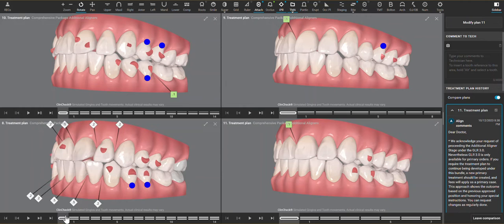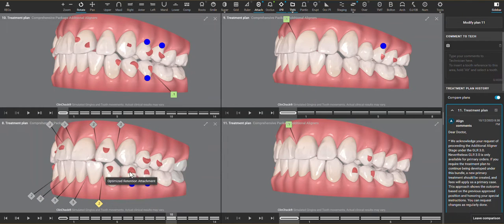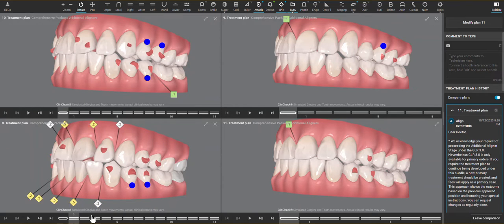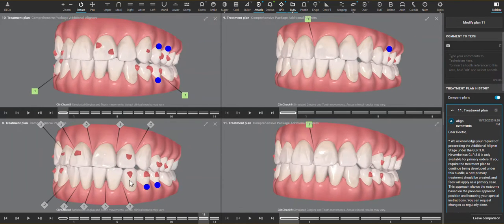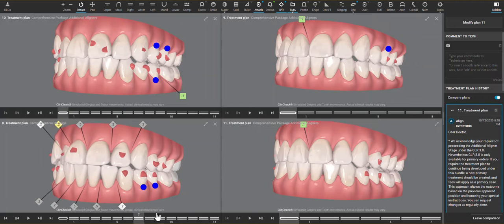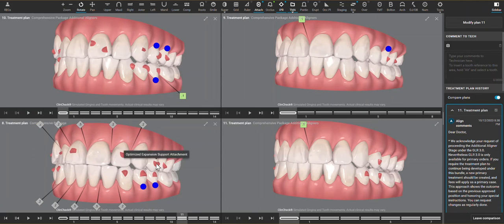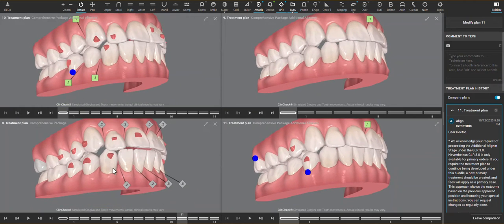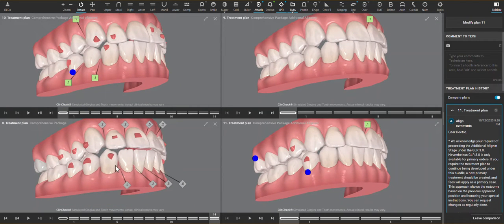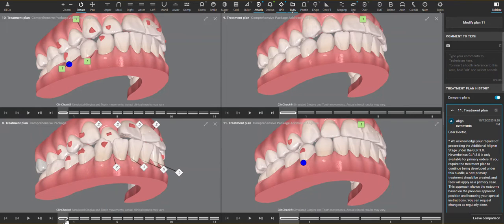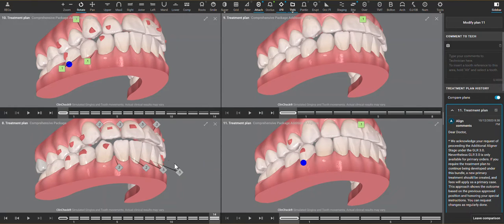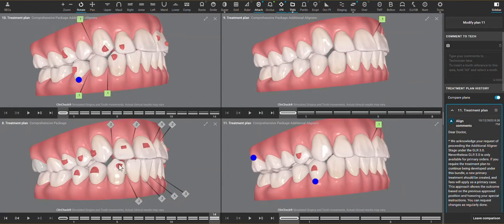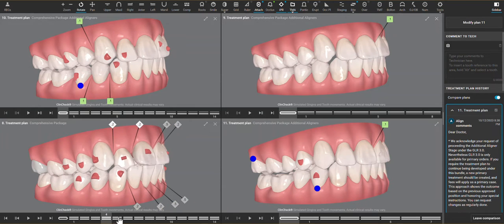There were a few movements that were difficult to do that may not have executed 100%, such as the extrusion of these lower premolars, possibly the intrusion of this canine, although there were some good retention attachments to help facilitate that. The end result is finishing with some anterior clearance as the upper lateral comes buccal, and then the canine comes in. The molar crossbite is left alone, which I think is a good thing.